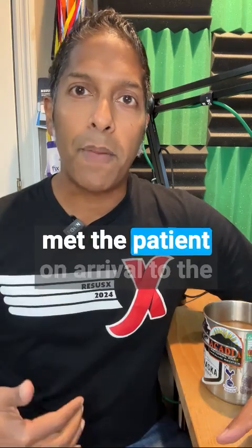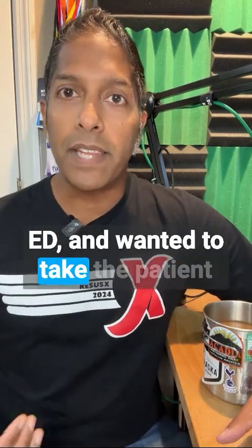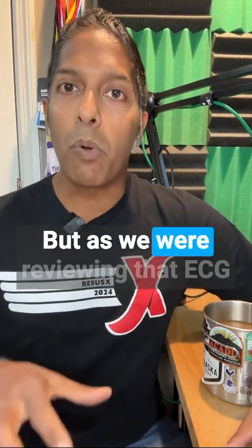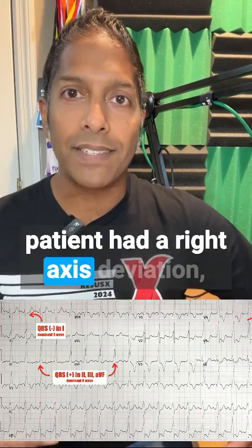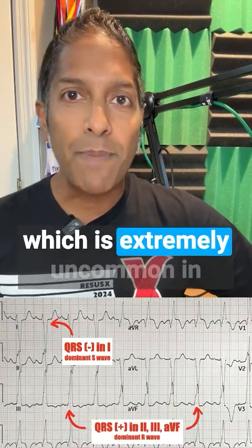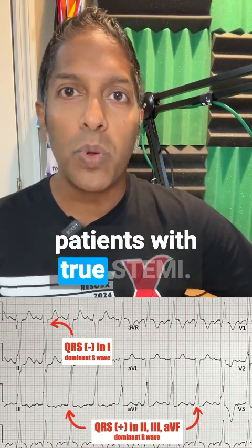The call went in from the field for a STEMI activation. The cath team met the patient on arrival to the ED and wanted to take the patient up for cath. But as we were reviewing that ECG a little bit further, we saw that the patient had a right axis deviation, which is extremely uncommon in patients with true STEMI.